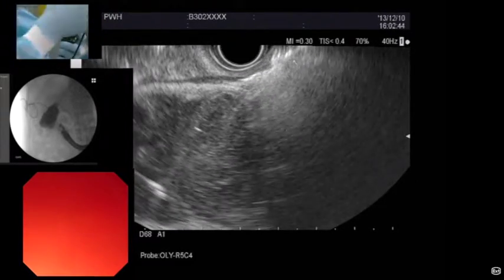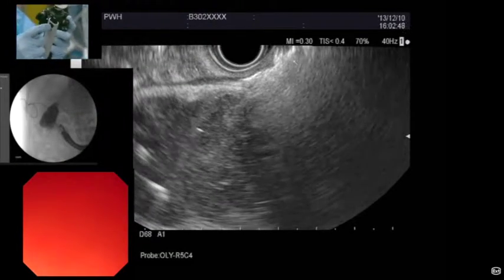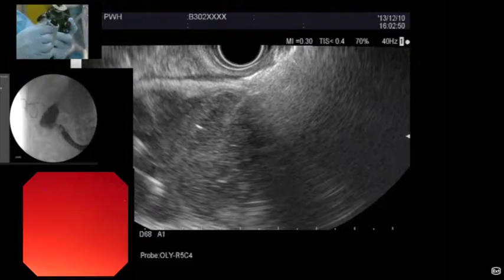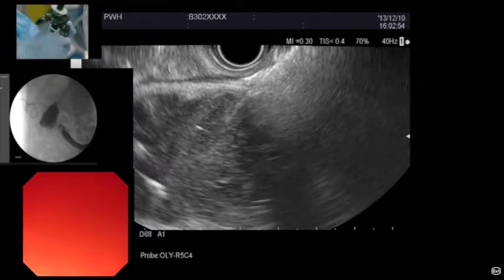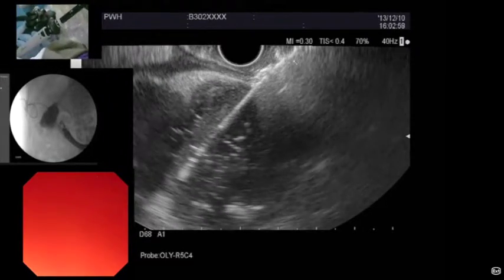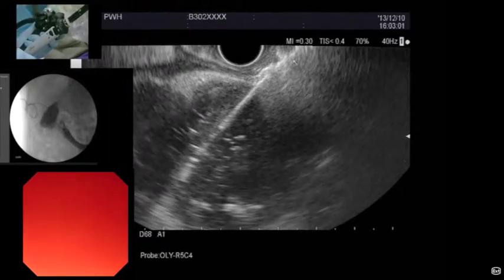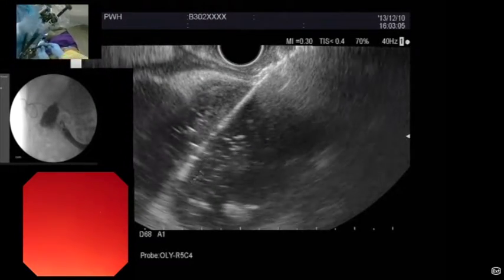And I'm in. All right, now as soon as I'm in, I am going to lock the sheath. There it's locked. The next step, I'm going to unlock, and let me see if I can just show you the catheter a little bit better. I'll just torque a little bit. Do you see that? Do you see the lengthwise echogenicity of the catheter? Just hold that a little bit counter. Yes, very well. Very nice.